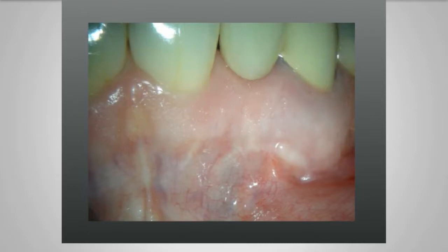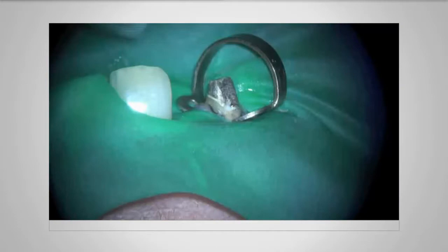So the question in this case was, do we treat the tooth surgically or do we treat it non-surgically? Well, the patient didn't want to have more surgery, so we had no choice but to disassemble the restoration and treat this non-surgically. Treatment obviously was carried out in a single visit because the patient can't be left with no restoration anteriorly. So the first thing I've done is remove the cantilever bridge, and underneath I've got the core material. This is a cast core. You can see cement lute around that, and then the ferrule of dentine from the tooth.